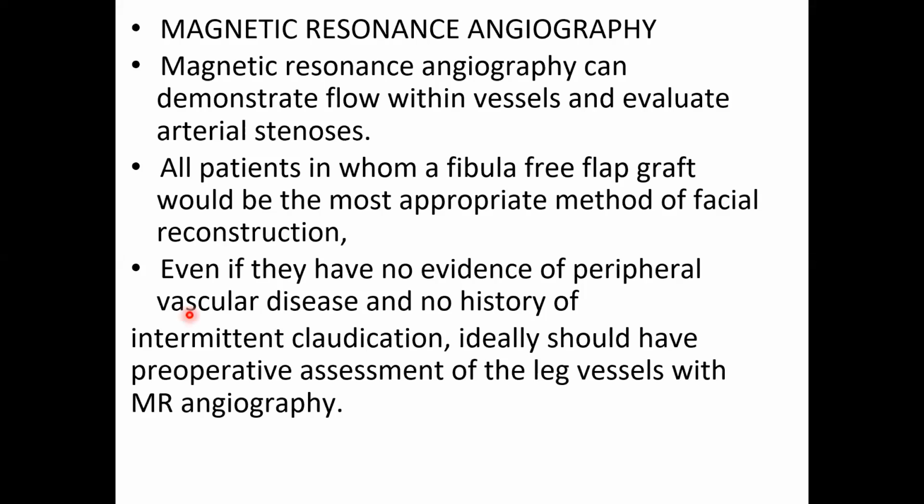Magnetic resonance angiography can demonstrate flow within vessels and evaluate arterial stenosis. All patients in whom a fibula-free flap graft would be the most appropriate method of facial reconstruction, even if they have no evidence of peripheral vascular disease and no history of intermittent claudication, ideally should have pre-operative assessment of the leg vessels with an MR angiography.